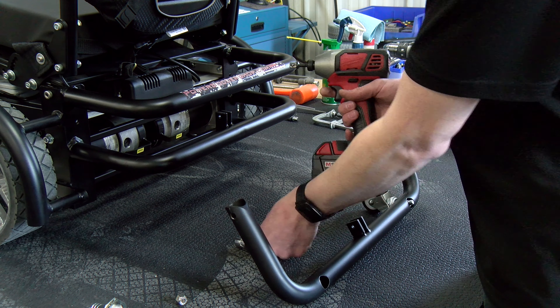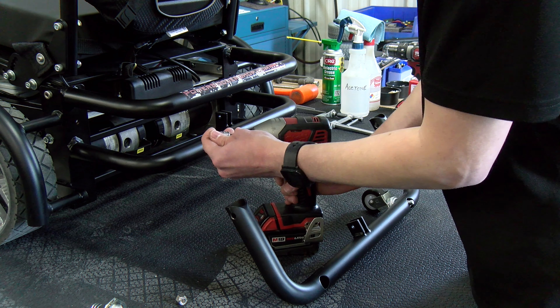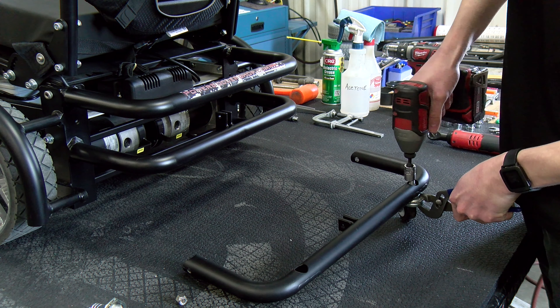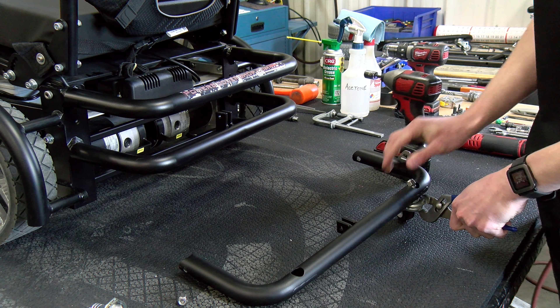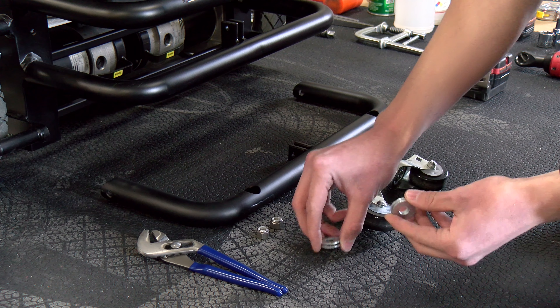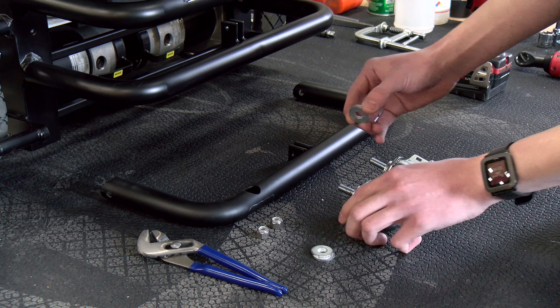If you have one, you can also use an impact driver — this will definitely speed things up. Now we can add the washers. We are going to be adding two to each rear caster. After we get everything reassembled, we will compare the results.